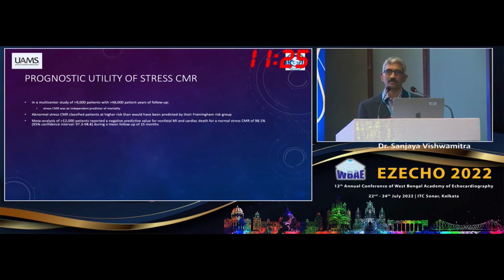So yes, you're able to maybe find the areas of perfusion defects to a better extent, but does it really make a clinical difference? Does it really make a difference to the patient? And essentially, articles have looked at over 9,000 patients in a multi-center trial, and they have come to the conclusion that stress CMR is an independent predictor of mortality, and I'll show you some more slides based on that.